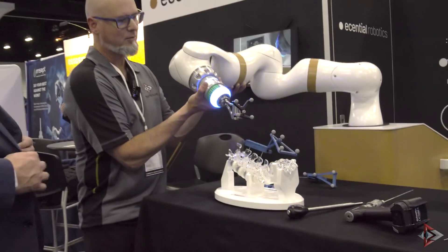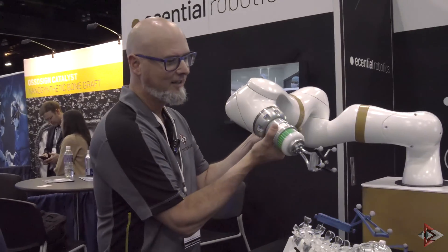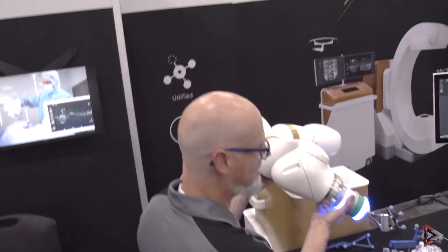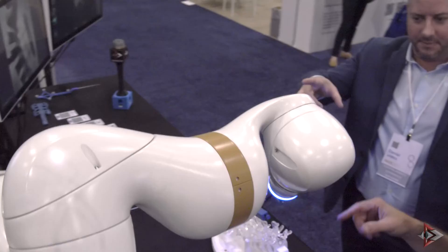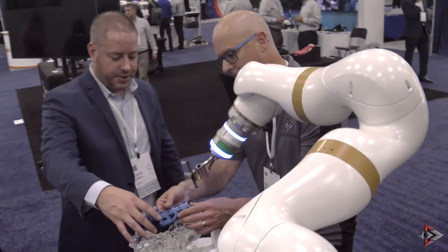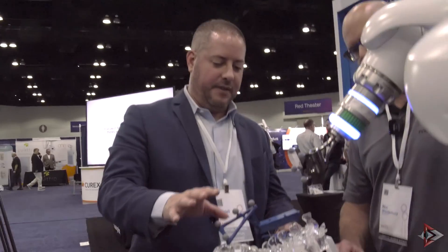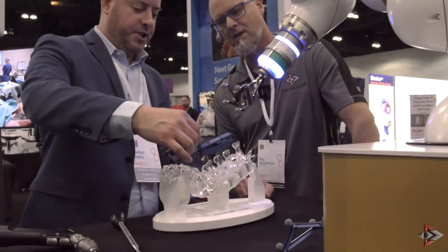I can cradle it like this — it gets to the spot a little bit easier. It looks like it's going to be heavy, but that twist just takes a little bit of strength in the wrist and then it goes. How does this piece attach? It's magnetic, which is nice — because if you're in the middle of a case and it gets bumped off, no big deal. You don't have to come and do another registration or another spin, just pop it back on. And if it's in your way, take it off for a second and put it back on.